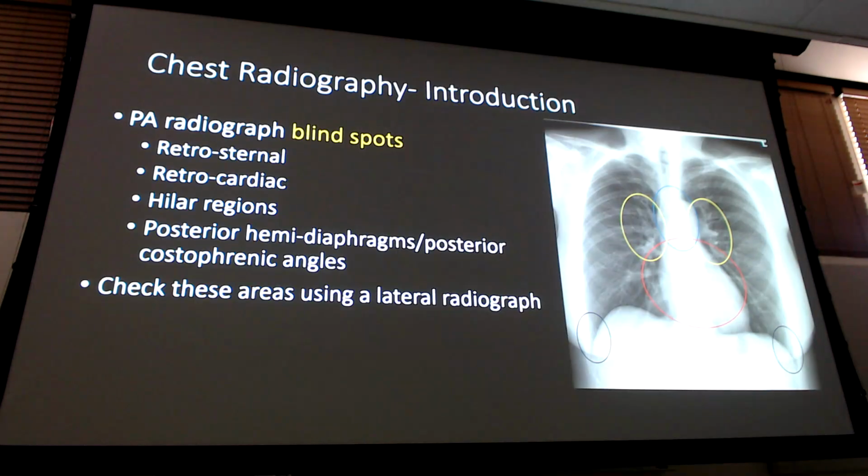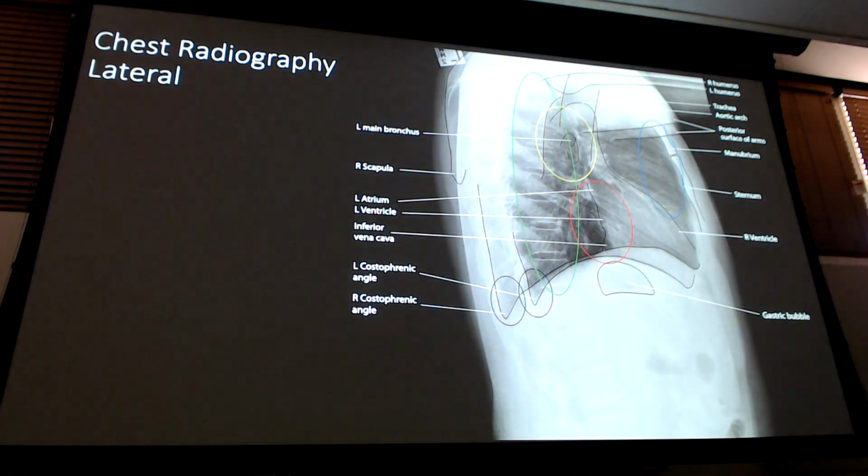Not to be confused with the PA. It's because of the liver, not because of the magnification, right? Biggest thing I want you to know from both of them is the right hemidiaphragm is supposed to be slightly higher than the left. That is not abnormal. They should not be in the exact same spot. That is not abnormal. Okay?